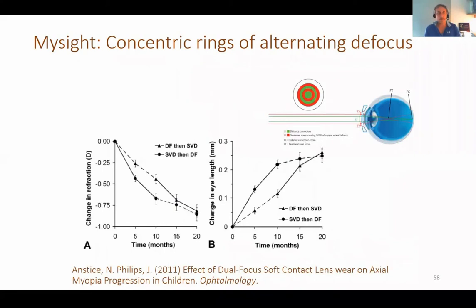That is the lens that is moving all the marketing worldwide for myopia control, because they made a big effort making good studies everywhere. And this lens has two rings. That's plus power rings. So green is for far, red is for near, and they try to obtain good results in children that have medium or low pupil diameter and children that have bigger pupil diameter. Last day we discussed what happens with the pupil diameter, and we know the child that has a bigger pupil size increases myopia more with glasses. So it's very important that the child has this peripheral refraction change, and that's why they add a second ring there.